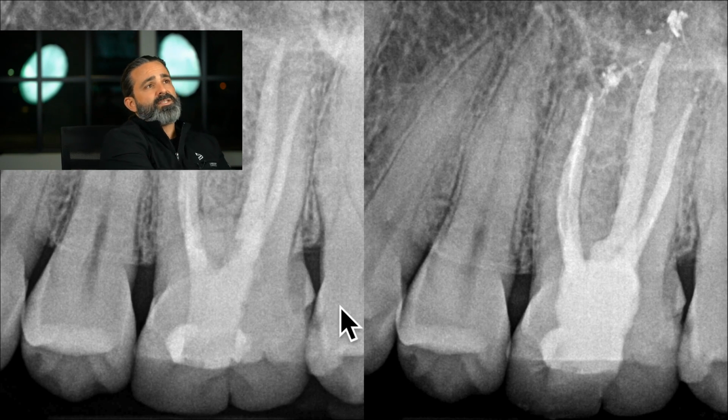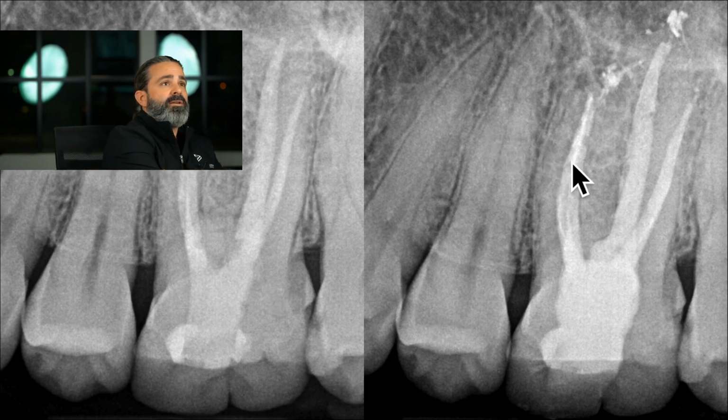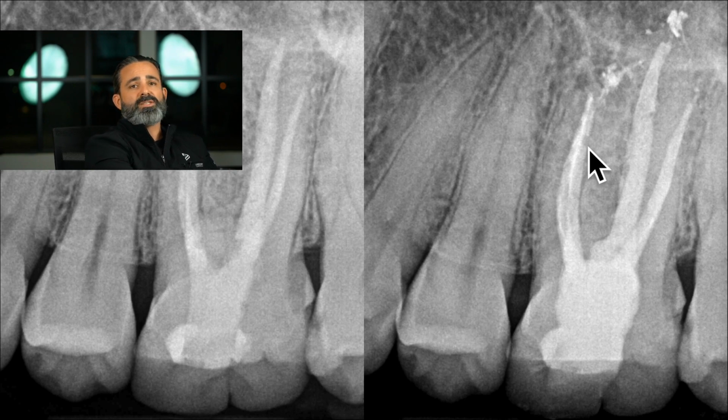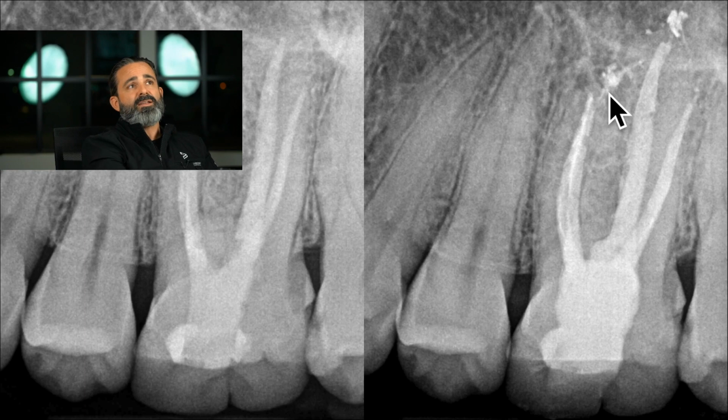You can definitely see some differences here. Now, where things are whiter, like here, these are connected spots. And sometimes you can see some voids or just less dense areas in there. But you can see that we did shoot something out to the side off of the main canal. And this was the make-believe spot I thought I saw on the CBCT. And it proved to be there.